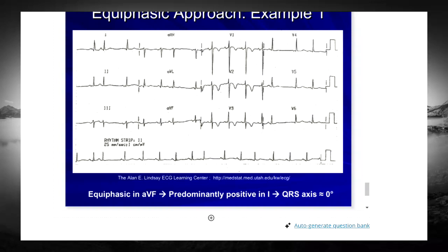Because now we're about to tell the pediatric electrophysiologist, where we're looking to figure out what the issue is with the electrical impulses. When they have to go map the heart, we need to know where they need to look, right? This tells us exactly where that axis is, so we have an exact number for what that axis is.